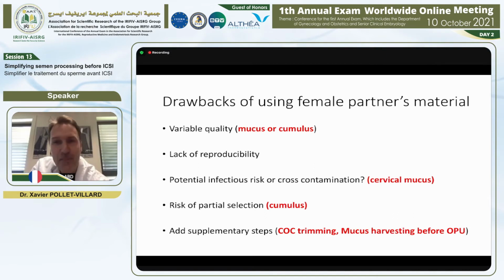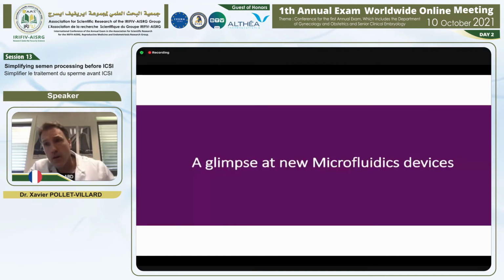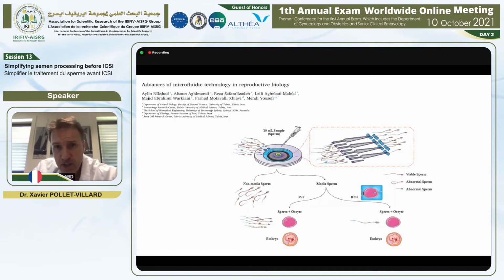But I mean, if you do the trimming in your lab every day, this is not a supplementary step that is difficult to overcome. So very shortly, because we don't have time, I want to take a glimpse at new microfluidic devices. So you know, the promise of microfluidics is that without centrifugation and using flow, for example, and channels, you can select viable, motile sperm, and use it for ICSI or IVF.